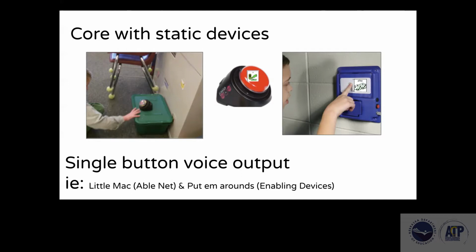There's a variety of different kinds out there with different companies, but you'll see that the student on the left here, again, we had a voice output core-based device for him and it just wasn't working. So instead what we decided to do, and we saw the magic happen and he saw the magic happen, is we put core-based phrases on devices in different areas of the classroom around the room. So for example, this is his break area. All of his favorite sensory items are in there. They're actually his favorite play items, we call them, but they are really meant for sensory.